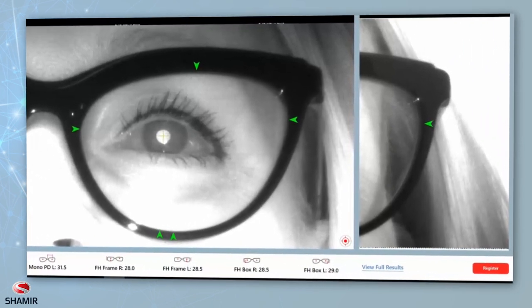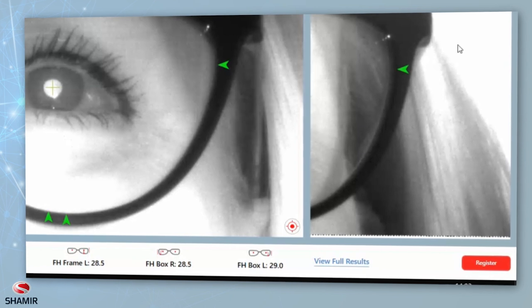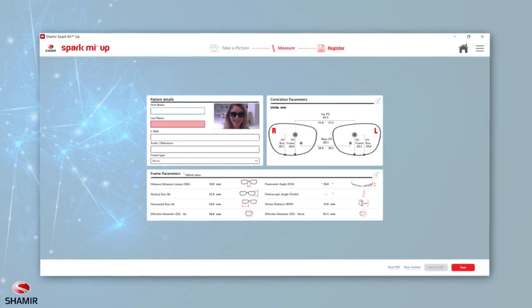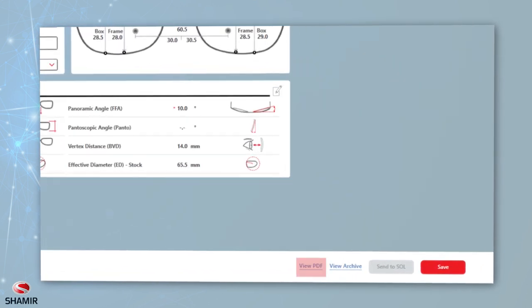Once you've marked all points and viewed the results, you can save the results. To do this, select Register, type in the patient's information, and press Save. Results can be emailed by selecting View PDF at the bottom of the results screen. An internet connection and an active email account on your PC is required.